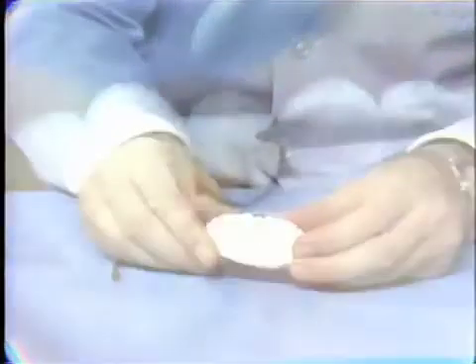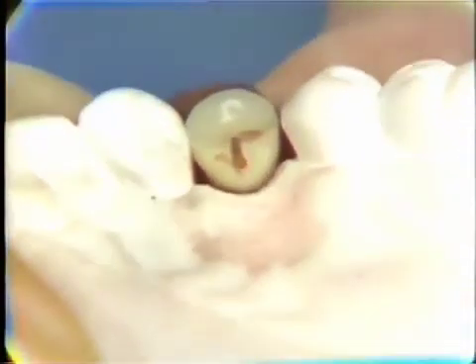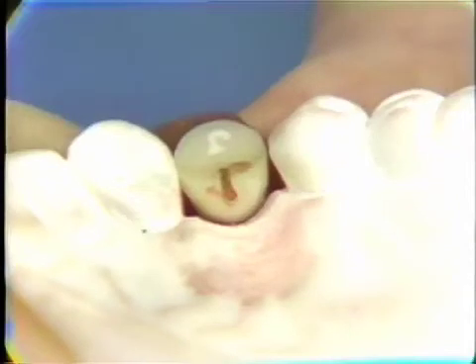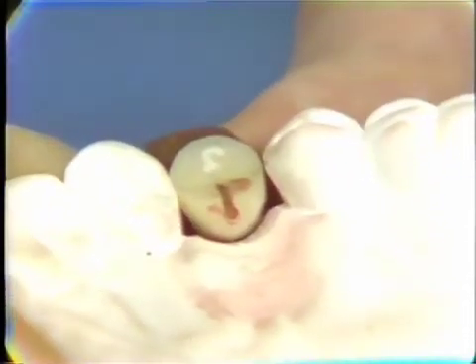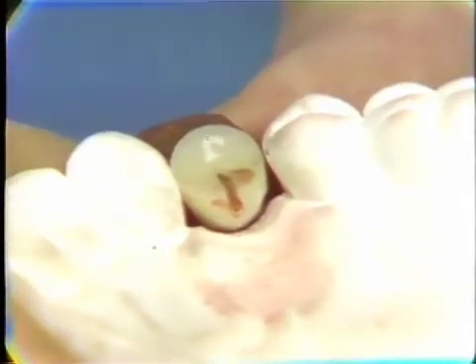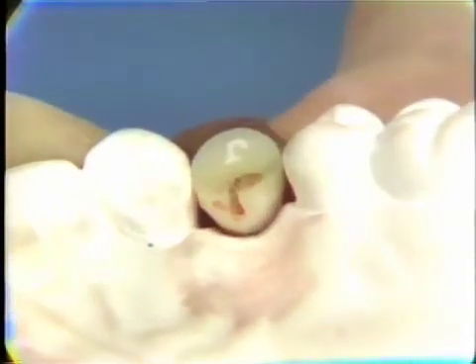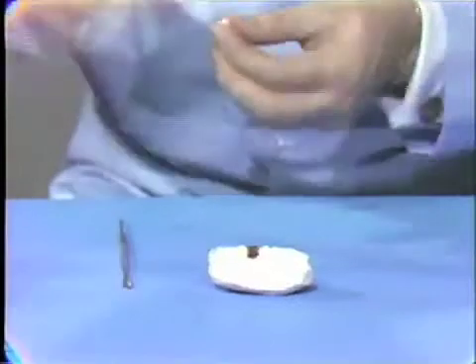Perhaps on a close-up shot you'll be able to see now that we've got a little better relationship in that area there. Still, I think that distal embrasure can be opened up a little. Notice the curvature there is rather marked convexity on the distal next to the bicuspid as compared with the mesial against the cuspid, where it sort of shoots further in. So I'm going to flatten off that distal surface just a little bit.